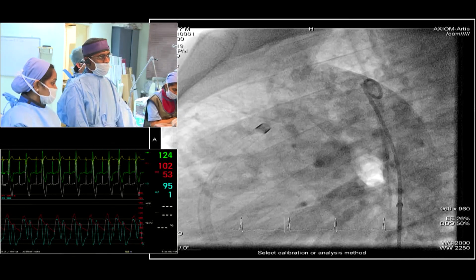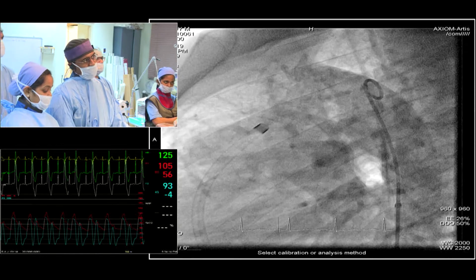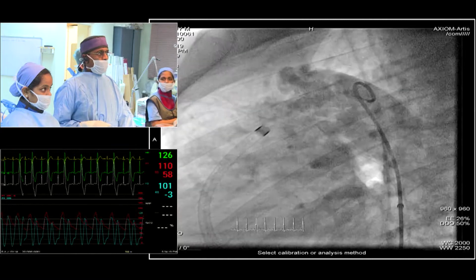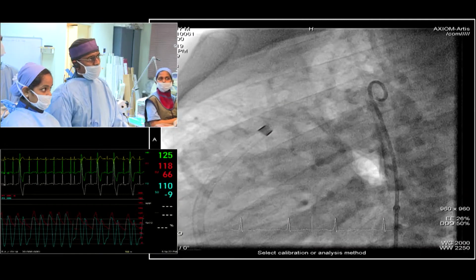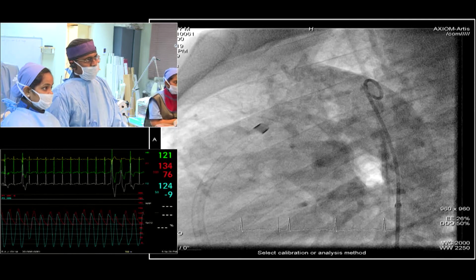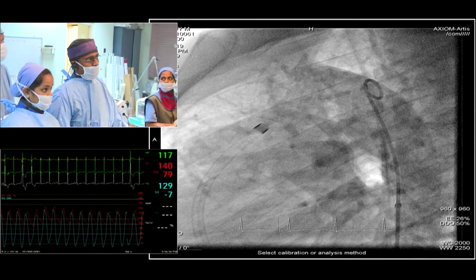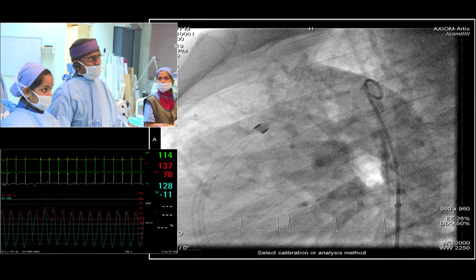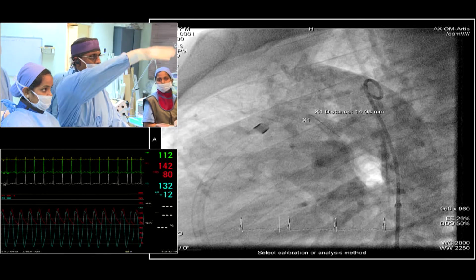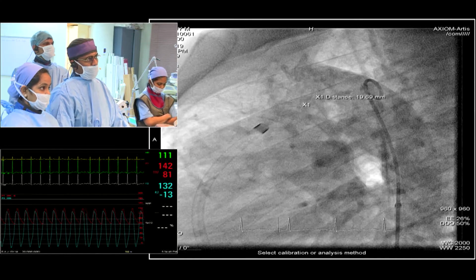You freeze the frame when the ductus is best seen. See, these are the difficulties of doing a ductus angiogram whenever the ductus is too large. Now freeze it. Go back. Okay. Now start the measurement. No, it's much below. Starting from there, go up to the horizontal. No, go up further. Go straight up further. No, just a little below.